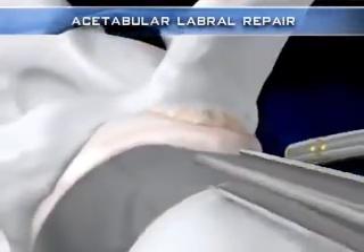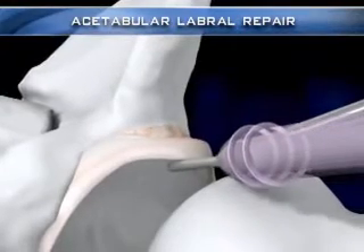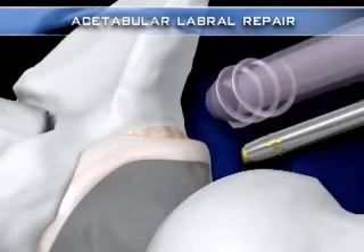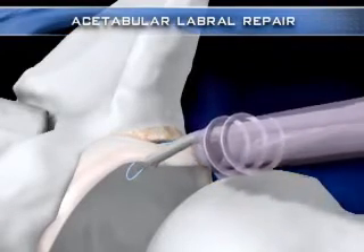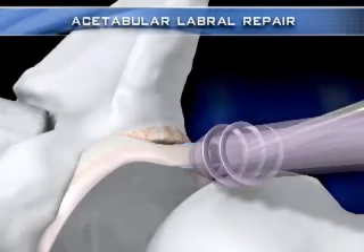Once adequate acetabular reshaping has been achieved, a clear cannula is introduced into the joint over a switching stick to aid in suture management during labral reattachment to the acetabulum. The penetrator suture retriever is utilized to position a number 2 fiber wire cinch stitch in order to capture the labrum prior to anchor insertion.